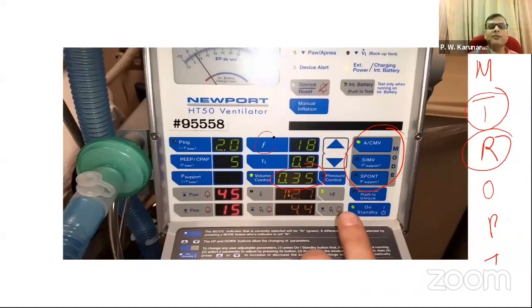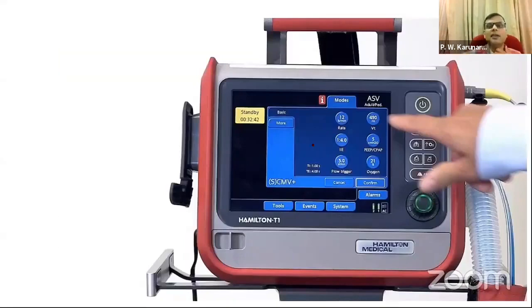Here it says frequency F, and you see where the oxygen is. Most probably it is on the side. So you can change the oxygen, and then the baseline pressure, PEEP. You have the PEEP, and then the IE ratio here. All the other parameters, even if you don't do anything, probably you can manage fairly okay. So this is another ventilator.